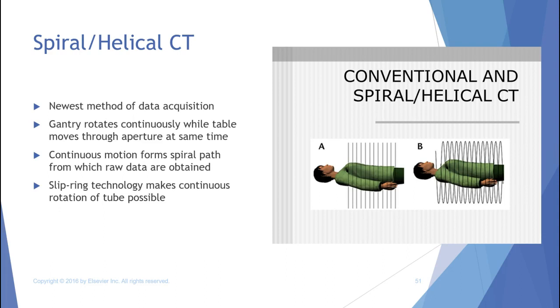By the way, you also do axial imaging for high-res chest scans. The industry standard right now for a high-res chest is you take a regular CT scan of the chest with them holding their breath, and then you take axial slices, about 10 up at the top apices, 10 in the center, and 10 down at the bases of the lung tissue, and that will give the radiologist the information that they need to make a diagnosis of interstitial lung disease. So that's another example when we use axial scanning in CT, for the high-res chests.